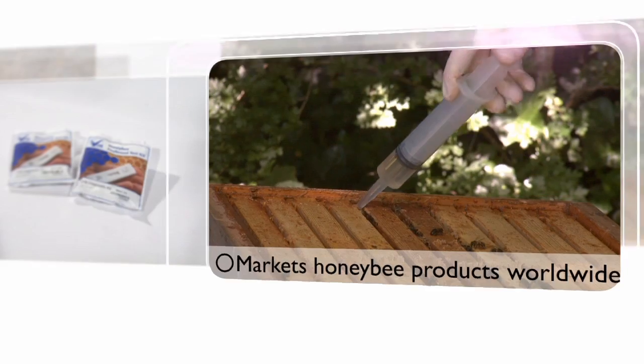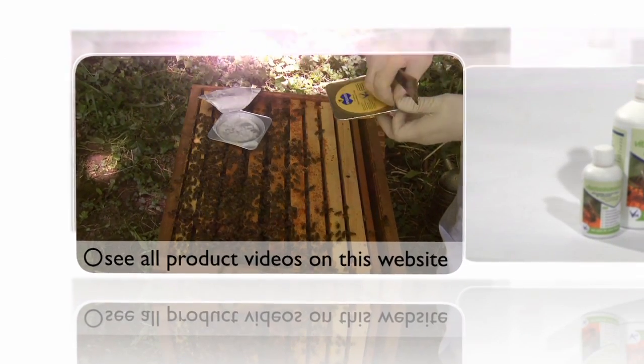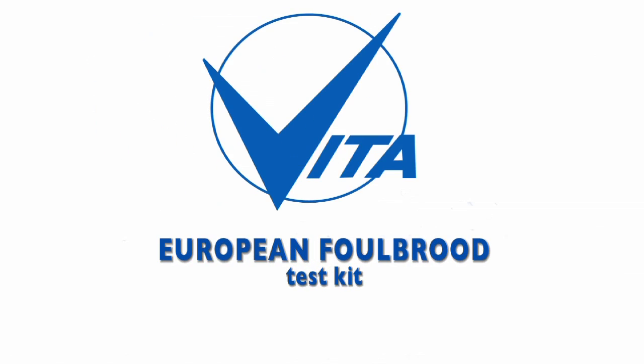Vitaeurope, the world's largest dedicated honeybee health company. In this feature, we take a look at the European Foulbrood test kit. We have a diagnostic kit for European Foulbrood, which is a bacterial disease of honeybees.